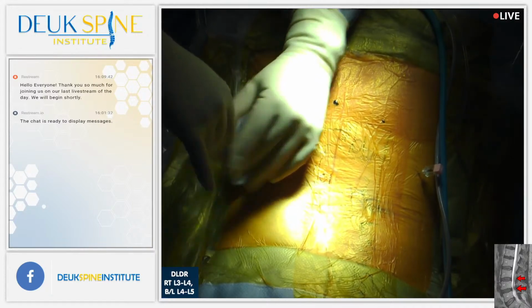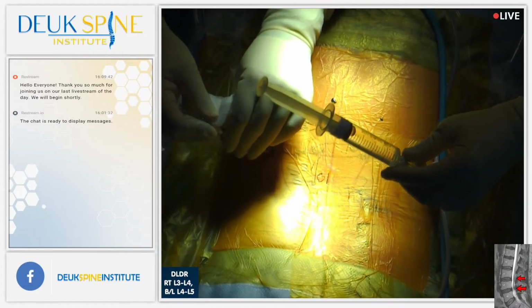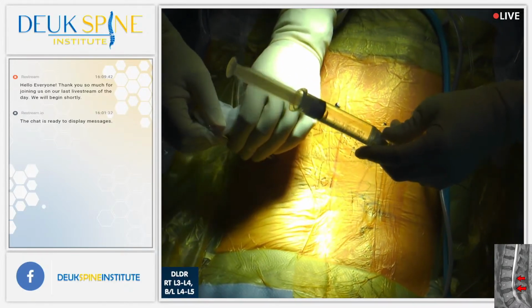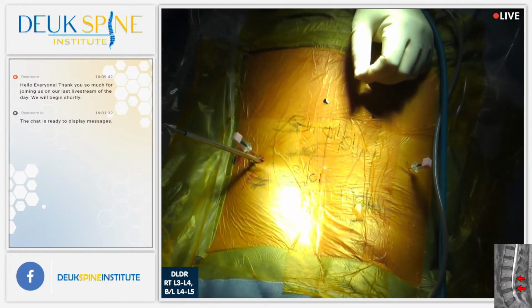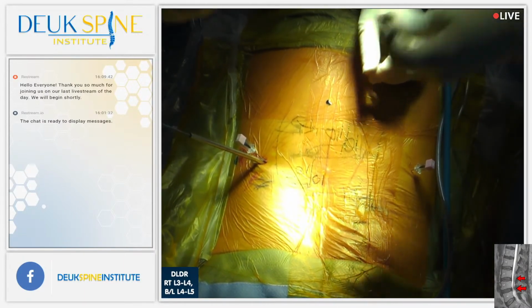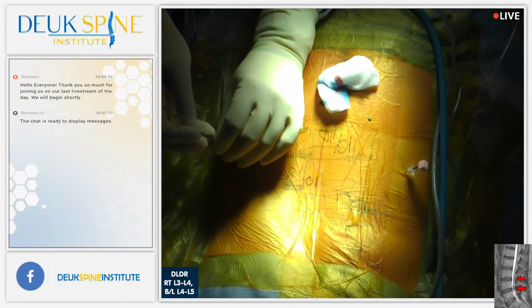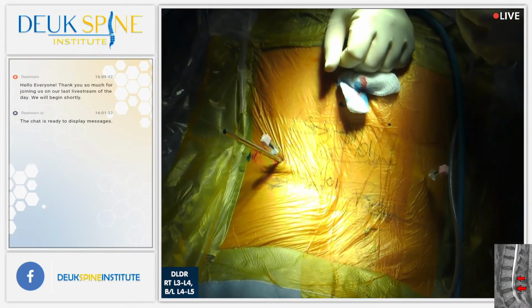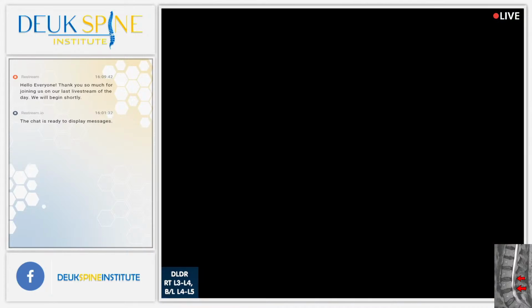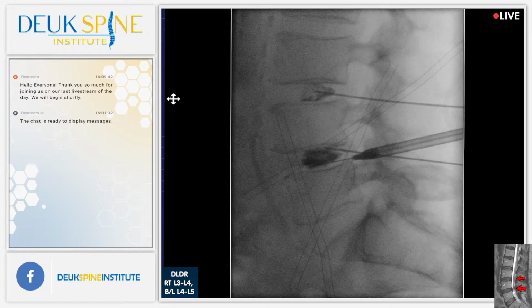She seems to be quite nicely laying here comfortably, so I wouldn't sedate her too much. You're doing great. Now she's responding a little bit more. Okay, sweetheart. All right, you're okay. I'm going to give you some more num-num. I don't know how much more num-num I can give her. We're at the disc. We use some num-num in the dye, right? Well, she's definitely awake now. Sarah? Let me know when you want me to proceed.